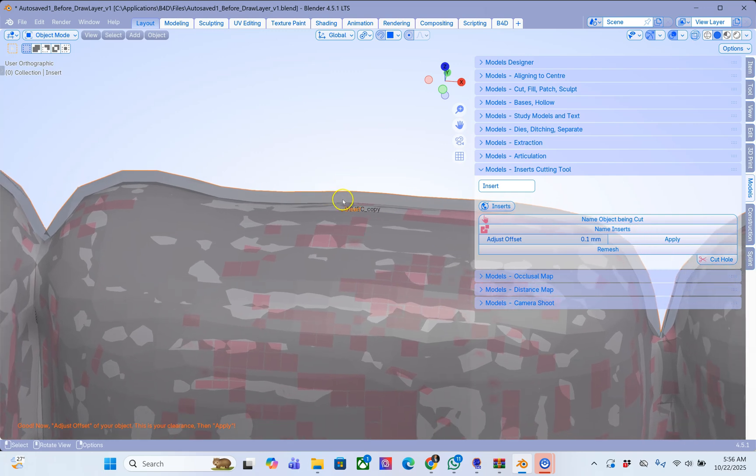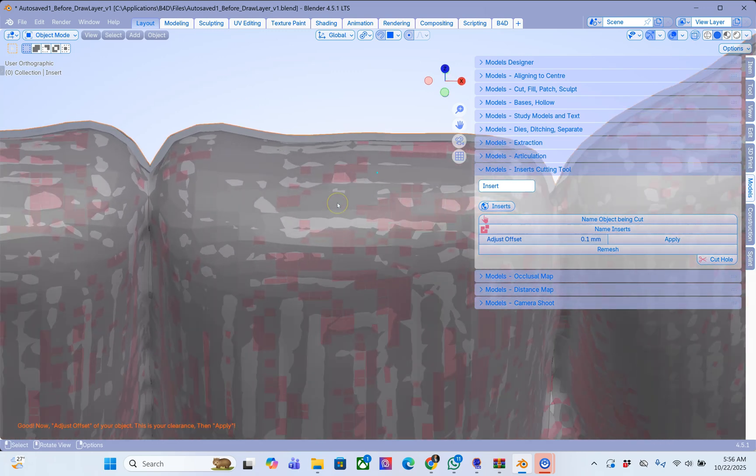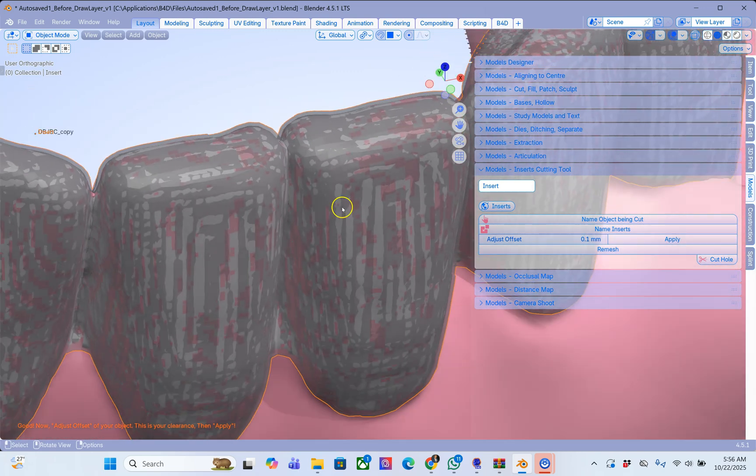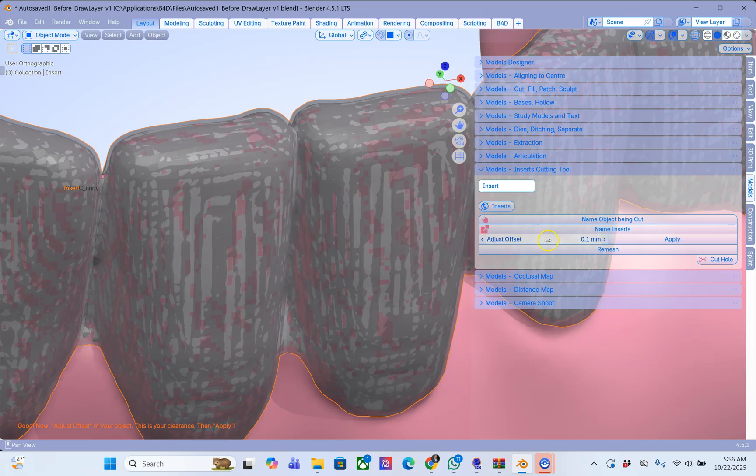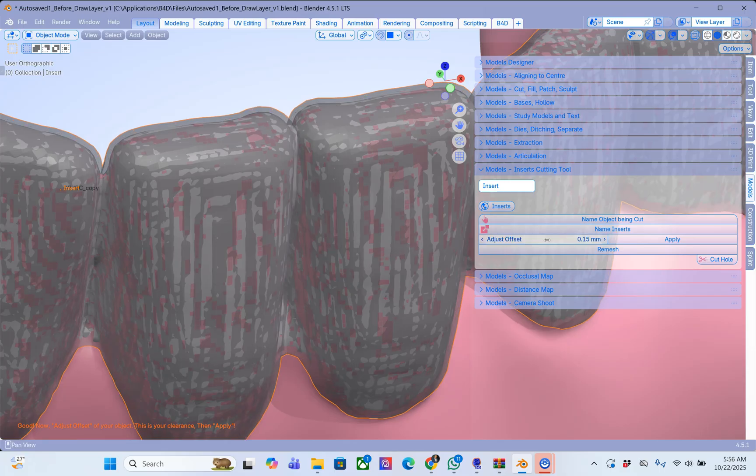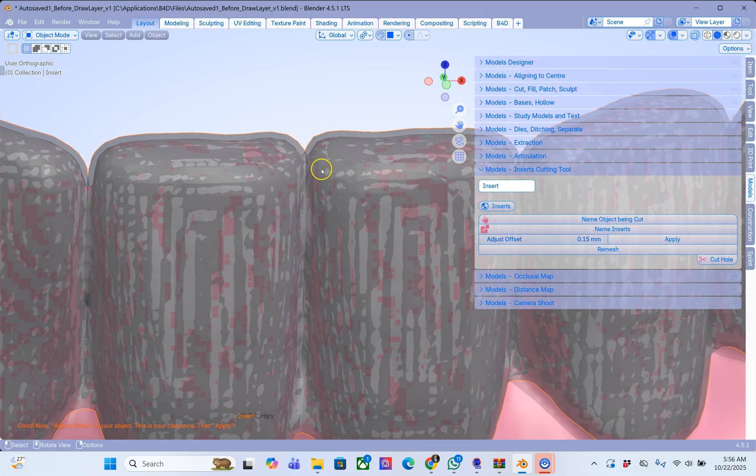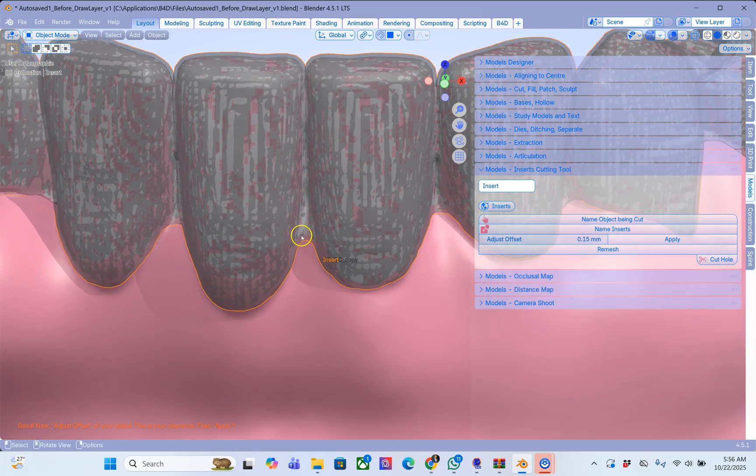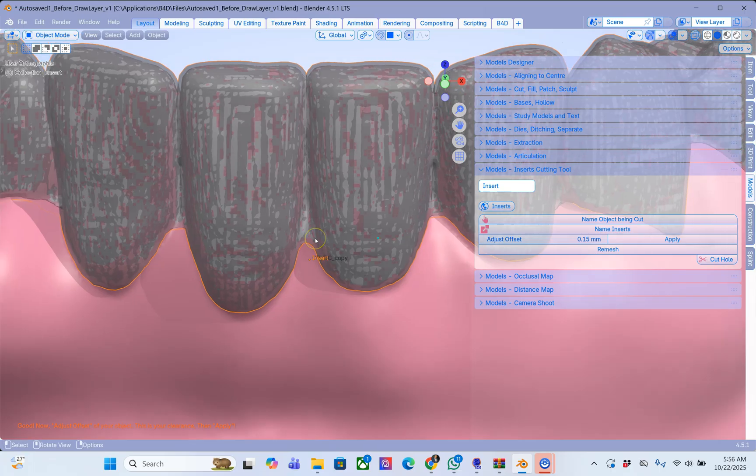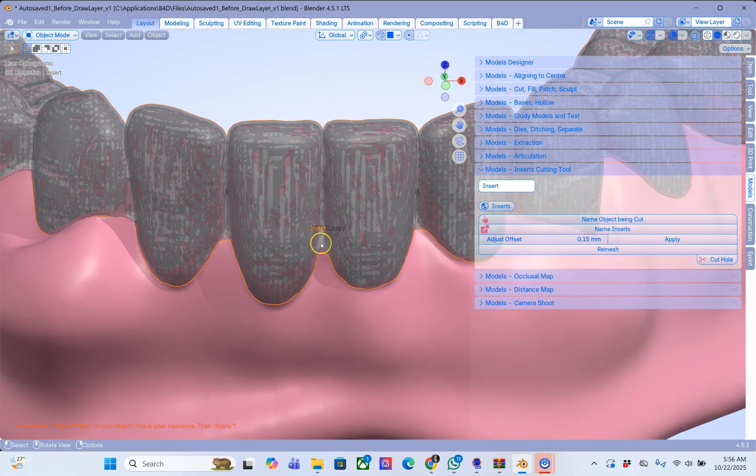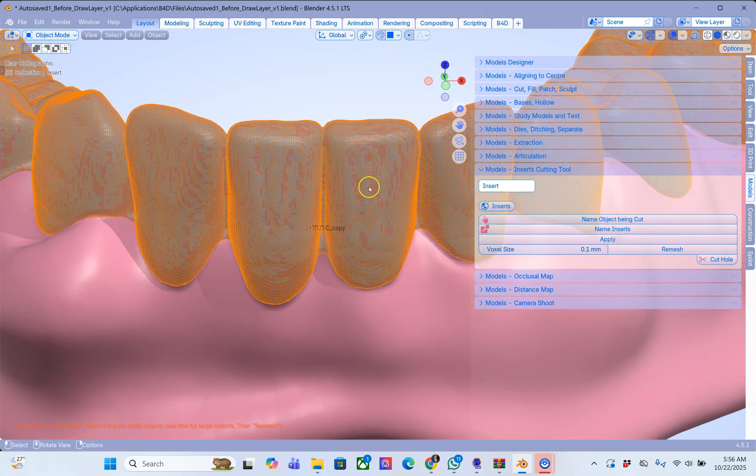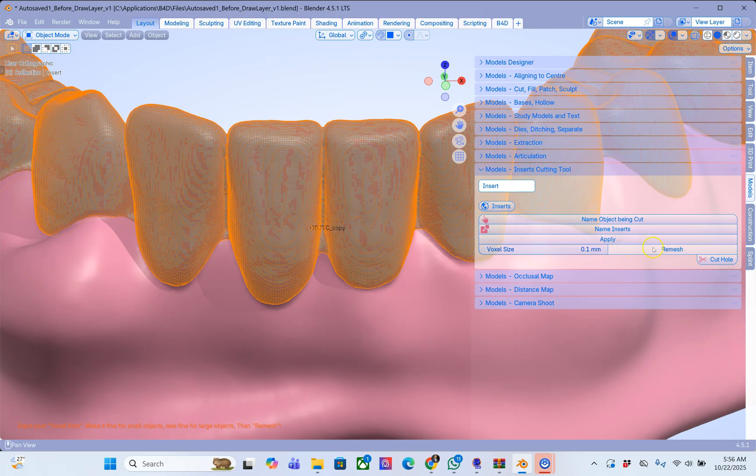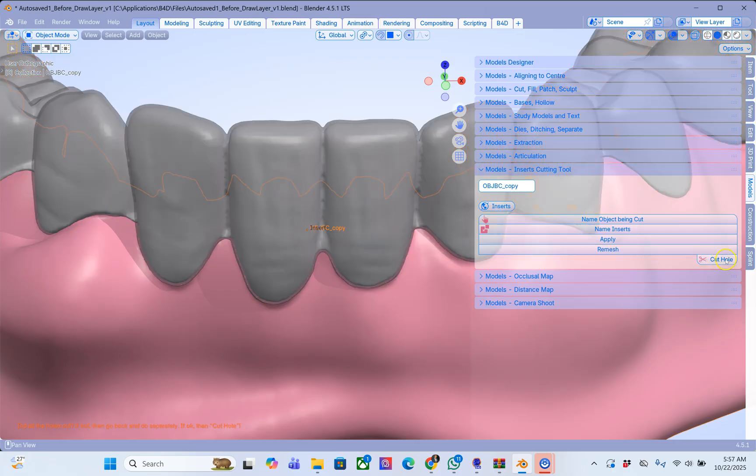Now this could be your glue or your acrylic or whatever. So let's put this to 0.15 or 0.2 depending on how much space you want to have between these objects. So then we are going to apply. It's going to remesh it at 0.1. Leave that. And then remesh and then cut, cut.